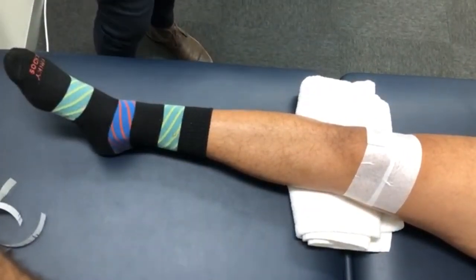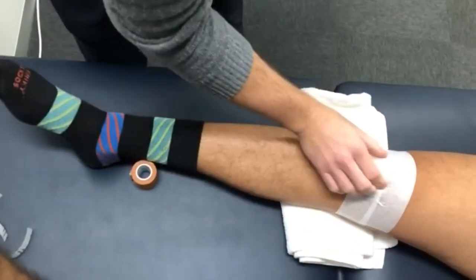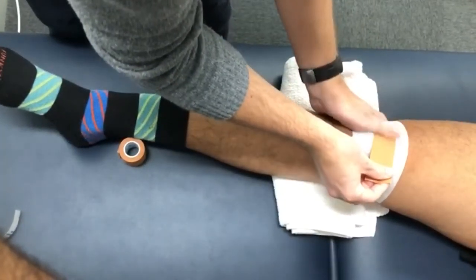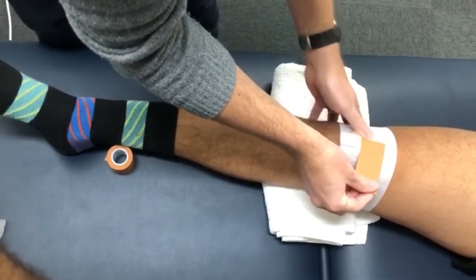Next we're going to use our rigid tape, which is important for support and stability. You're going to measure a small piece from the middle of your kneecap to the inside of your thigh or knee, and then paste it from the middle around that area approximately, rubbing it down with your thumb so the glue activates with a bit of heat and it sticks really well.